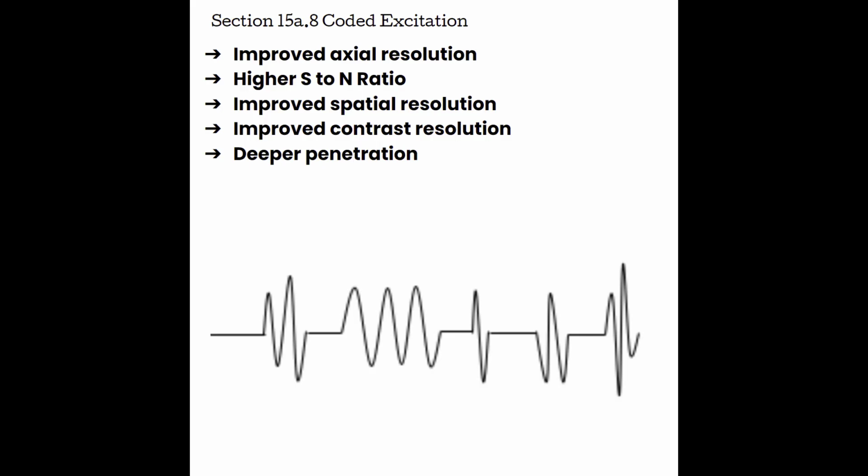We're also going to get higher signal to noise ratio. We're going to see improved spatial resolution, improved contrast resolution. We're actually going to get a little bit deeper penetration with the sound as well. This is typically just a built-in feature of our newer machines, not something that you would turn on or turn off. As a sonographer, it is included to optimize our imaging equipment.